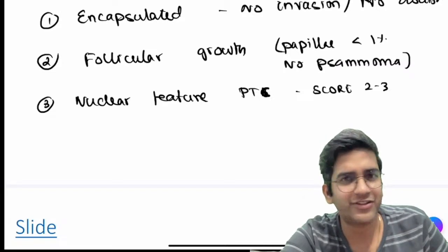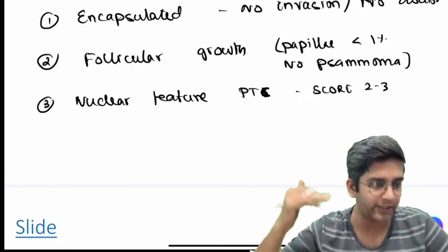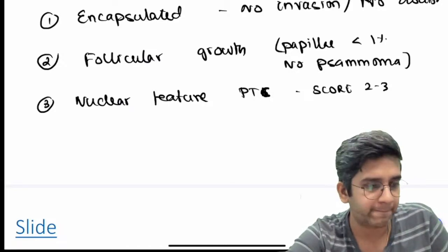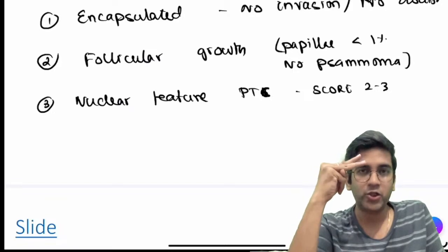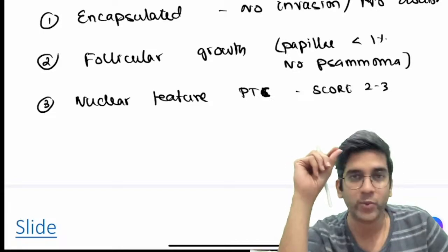Orphan Annie is something which you'll never forget, right? It's okay. If you're wrong, it's completely fine. Comment. Crowding, overlapping, nuclear enlargement. Perfect, Francis. Anyone else? Clearing. Super, right? So there are actually 3 points for me to call the nuclear features of the papillary thyroid carcinoma. Grooving, intranuclear inclusions, nuclear grooving, amazing, right?